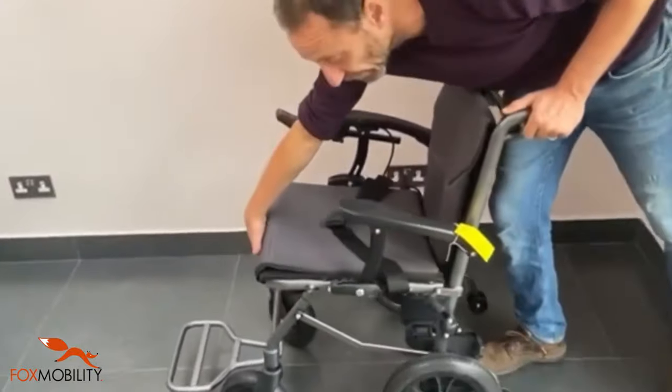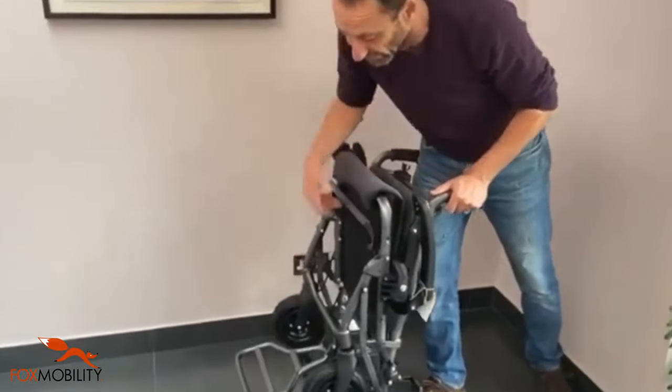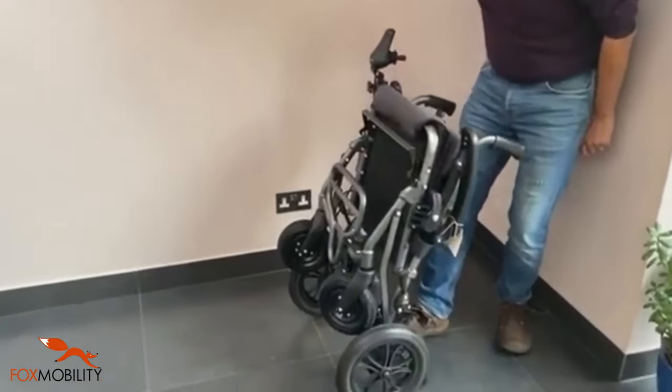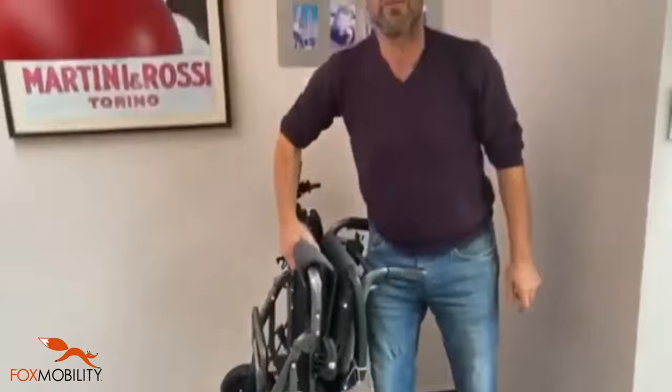Very easy to fold up — all you do is like so, bring that up like so. You have got anti-tip so you can stand it up nicely. That is the 14 kilo power chair. Thank you.